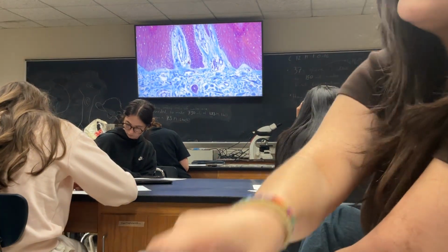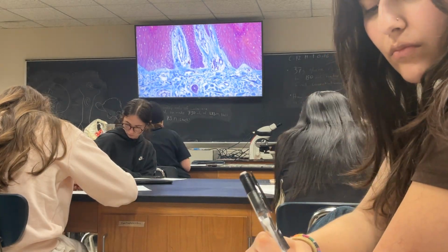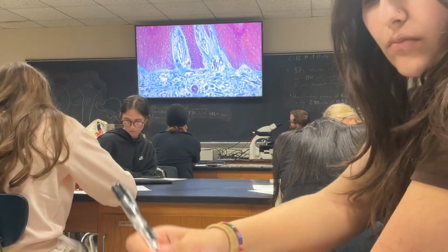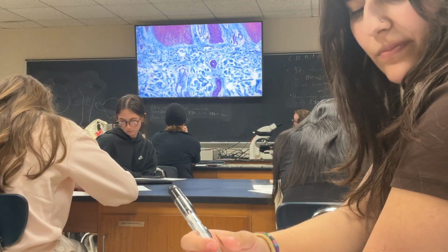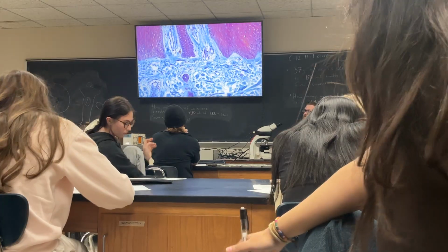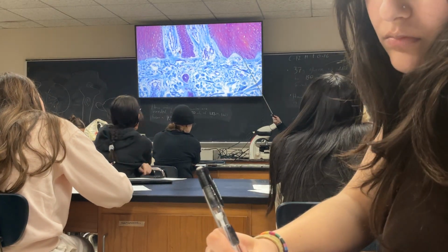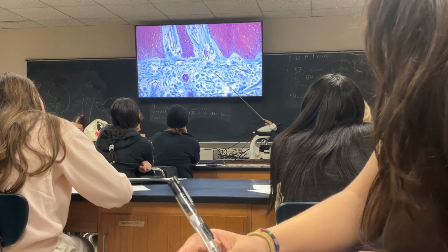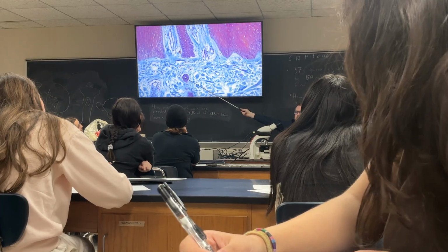The best place to find that is the reticular layer of the dermis, where we've spent some time before. So again, on the practical, in this one view, if you can study this as much as you're most comfortable with, that would be great. This is stratified squamous, this is areolar, these are capillaries, so there's simple squamous, and then there's dense irregular, and then there's stratified cuboidal. That's what I want.